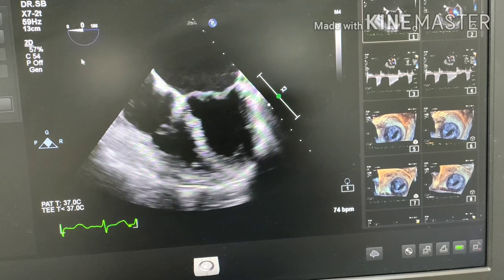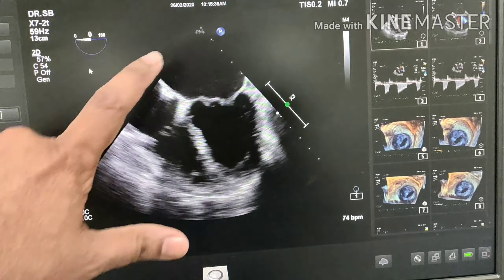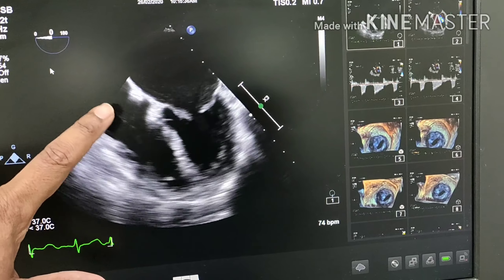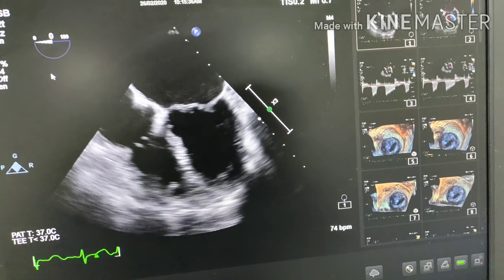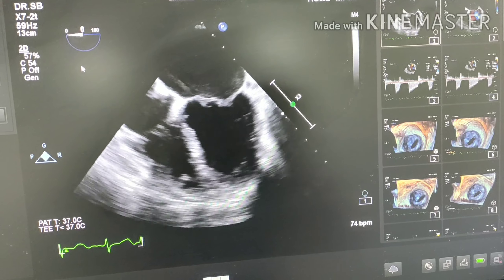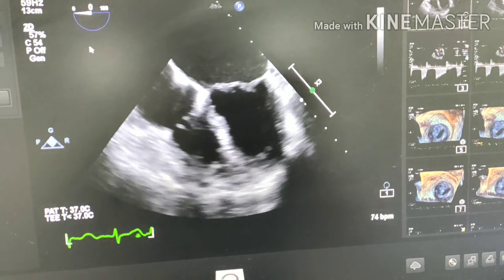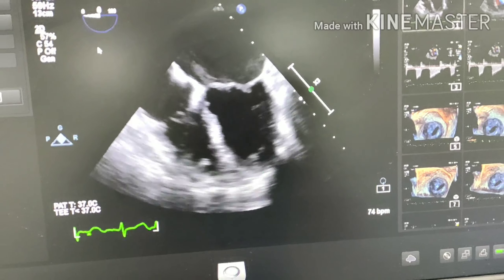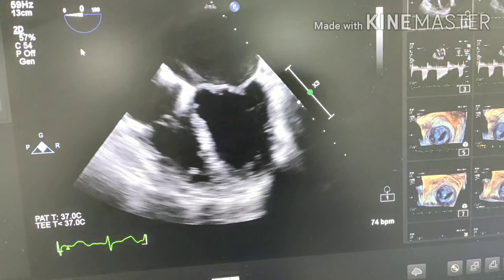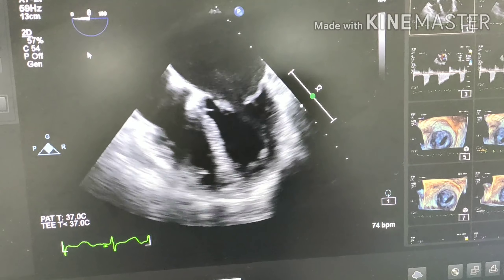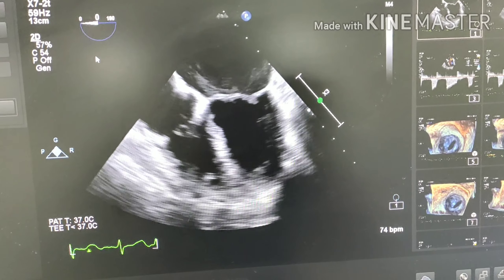This is a mid-esophageal four-chamber view where you can see the left atrium, left ventricle, right atrium, and right ventricle. You can see the stenosed mitral valve, with a fixed posterior mitral leaflet and a thickened and very restricted anterior mitral leaflet, along with an enlarged left atrium with some spontaneous echo contrast, otherwise known as smoke.